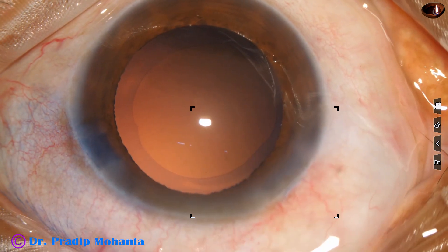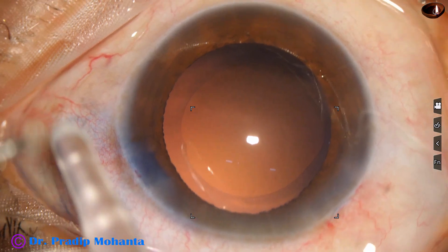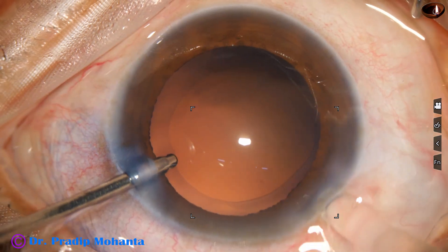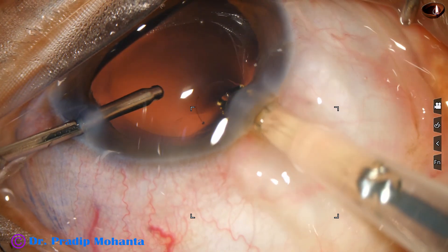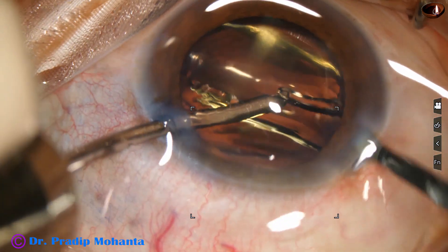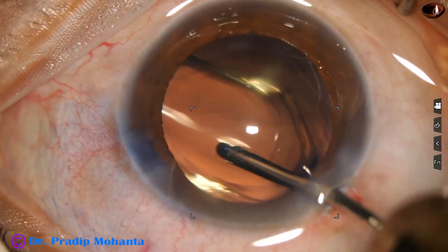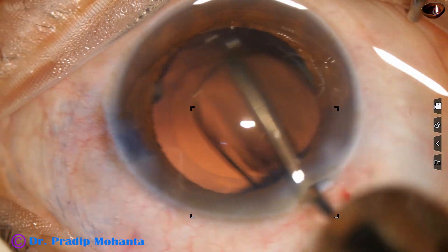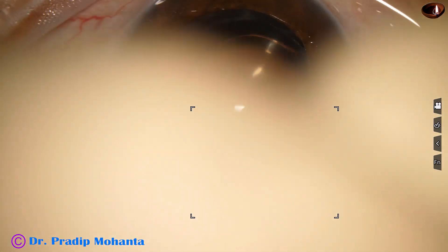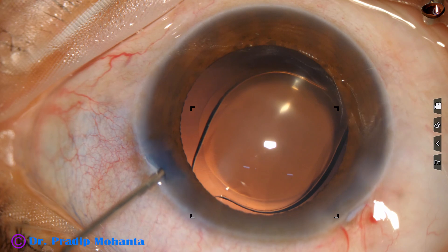Cortical cleanup is done and now is the time to implant an intraocular lens. This is hydro implantation. The anterior chamber is kept formed by the irrigating probe, and this is a hydrophobic acrylic single-piece monofocal intraocular lens. The lens goes into the capsular bag. The irrigating probe supports the anterior surface of the lens so that the lens doesn't become upside down. The lens is dialed by the irrigating probe.